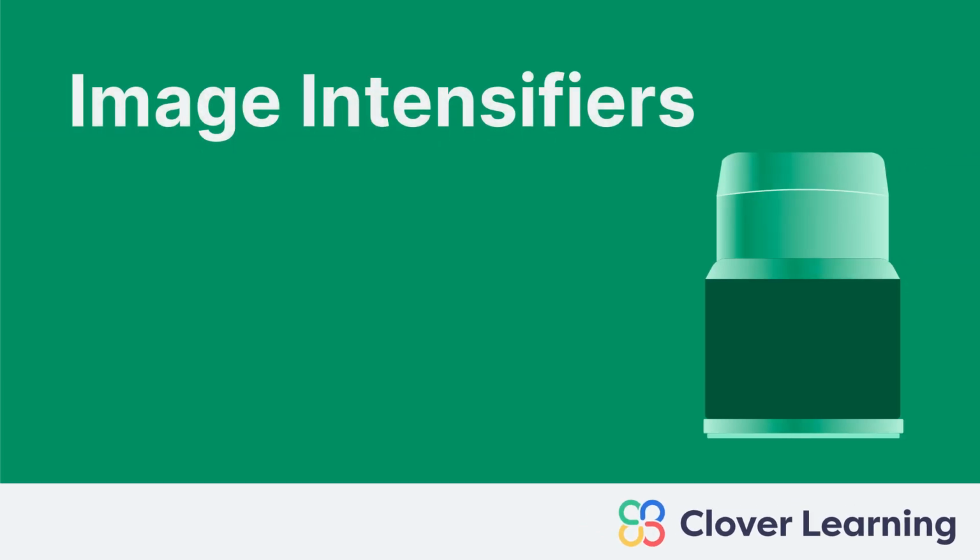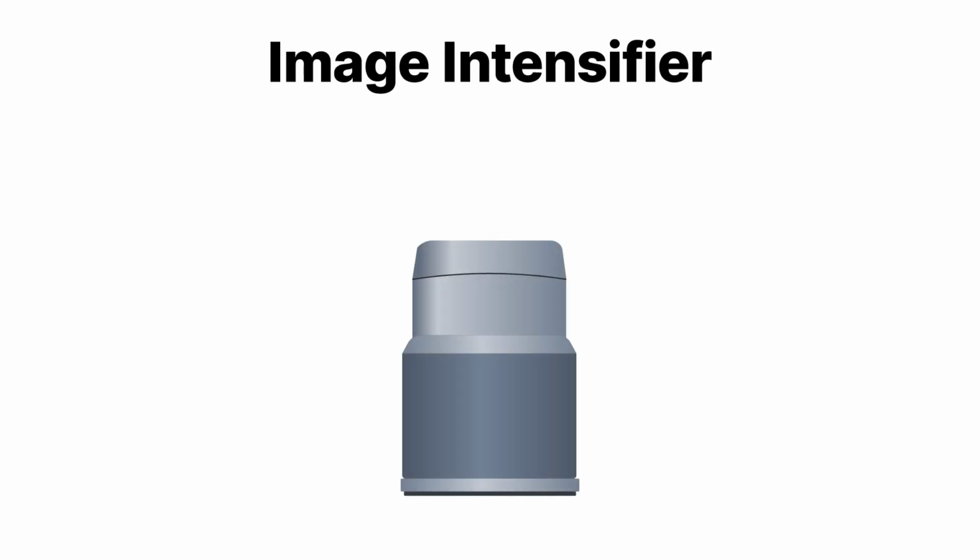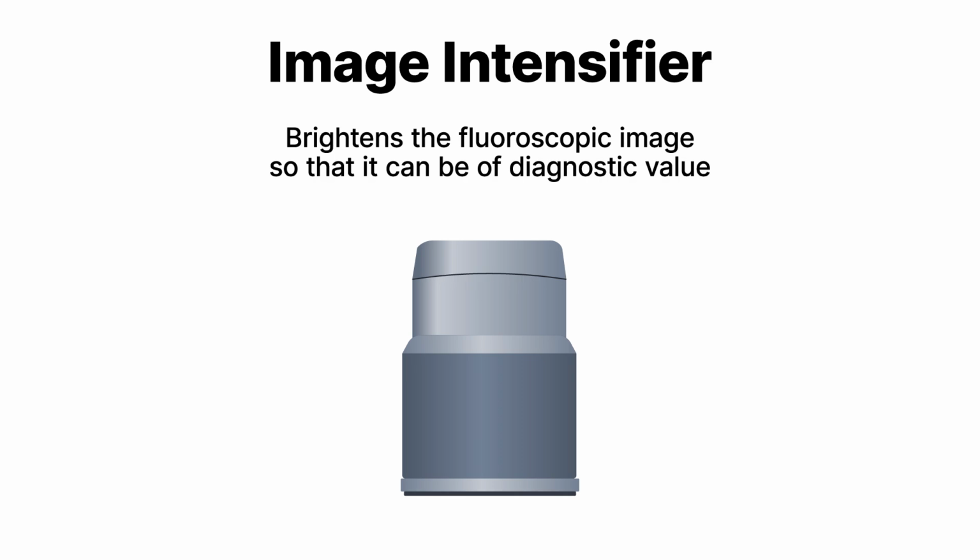Hey everybody, welcome. In this lesson, we are discussing the image intensifier, its purpose in fluoroscopy, its components, and how those components work together. The image intensifier is an important component of the imaging chain because it brightens the fluoroscopic image so that it can be of diagnostic value.